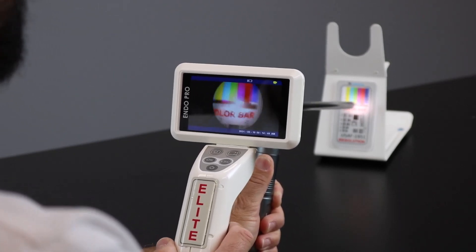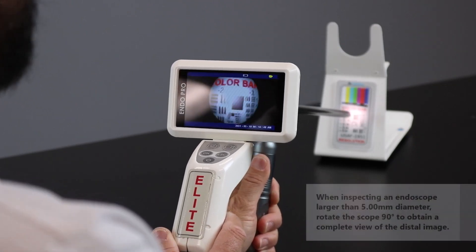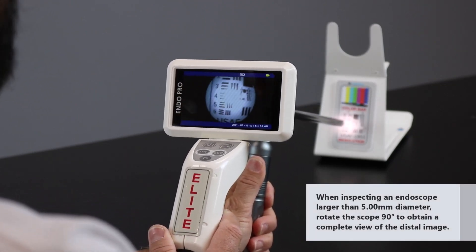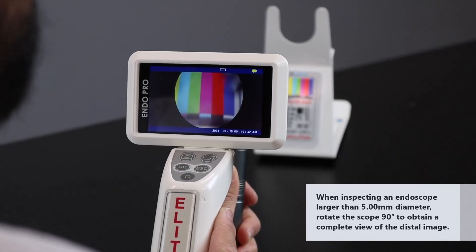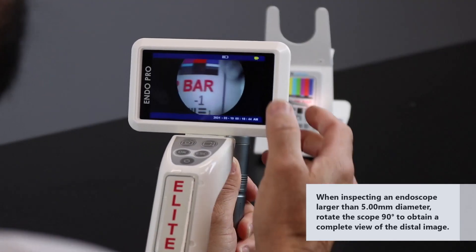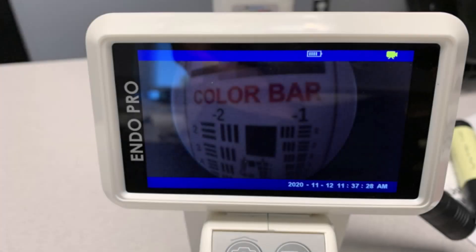What you're looking for is vivid color and clear and concise patterns and numbers. Now we've hooked up another rigid scope, and as you can see here, there's damage on the top right, which is a sign of a broken prism. Another type of damage could be when the display is darkened of any kind. This is a prime example of broken light fibers.